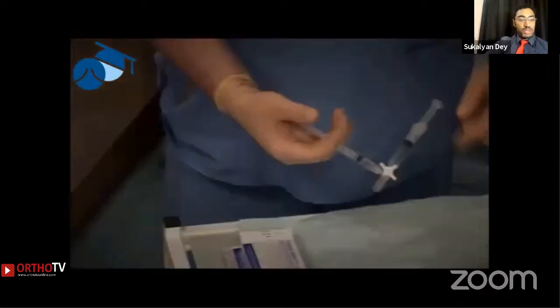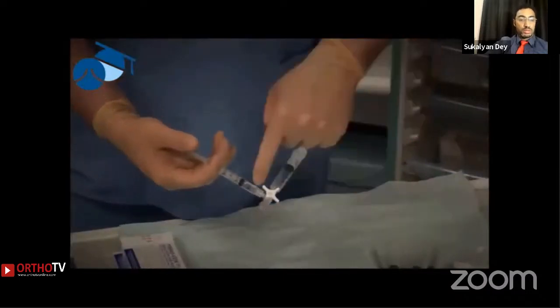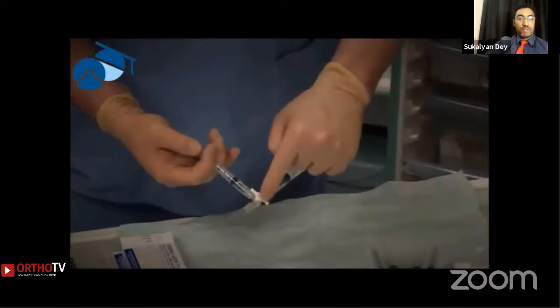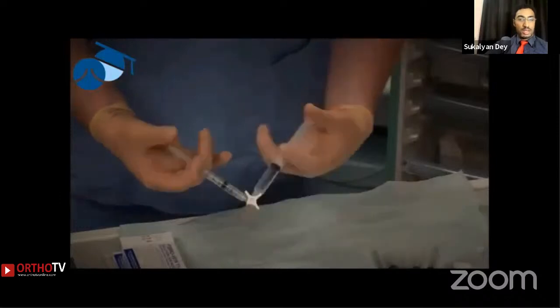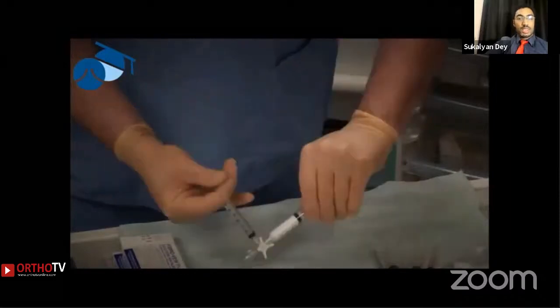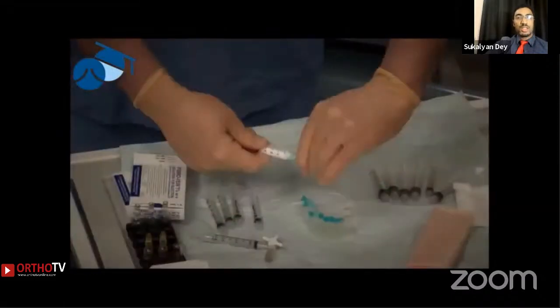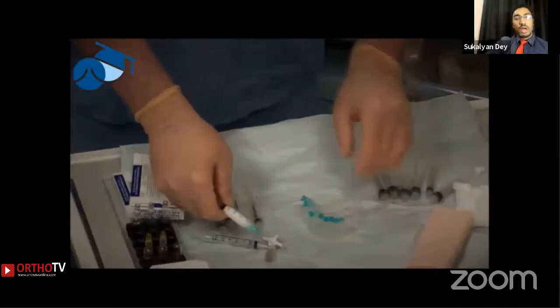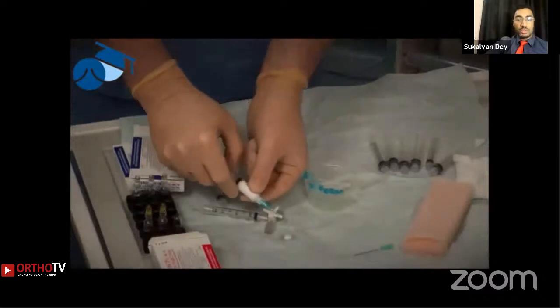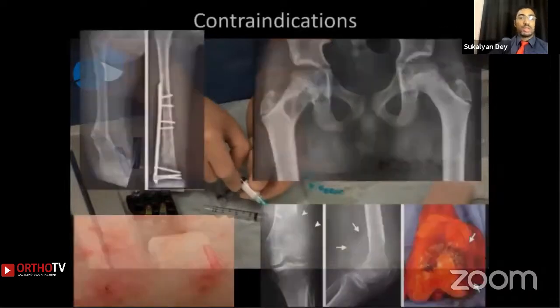Now we open the lock slightly, just enough to cause turbulence, and then the repeated to and fro motion of the pistons about 8 to 20 times will create a fine froth like this. It maintains its frothy consistency for a few minutes, and it has to be injected immediately into the lesion. If we take too small and too thin a bore needle, then the froth will be reconverted into liquid. So we should keep in mind that we use only wide bore needles.